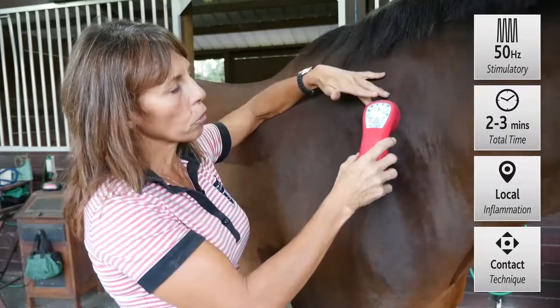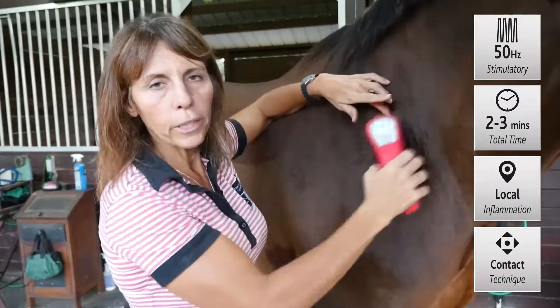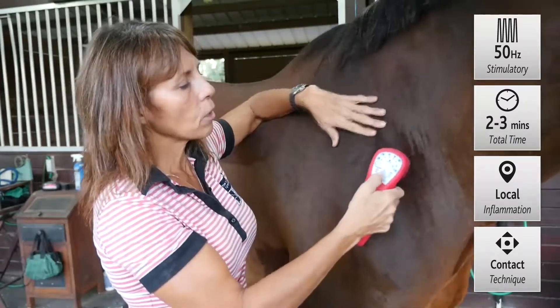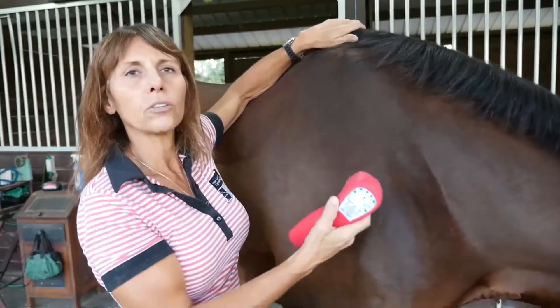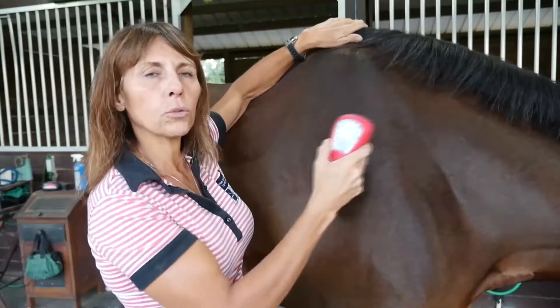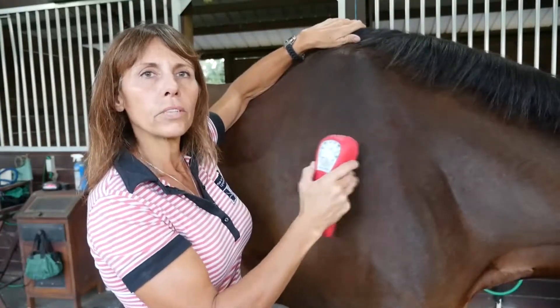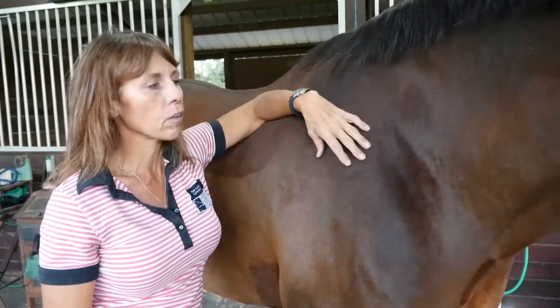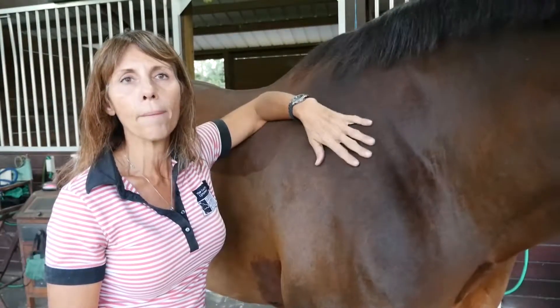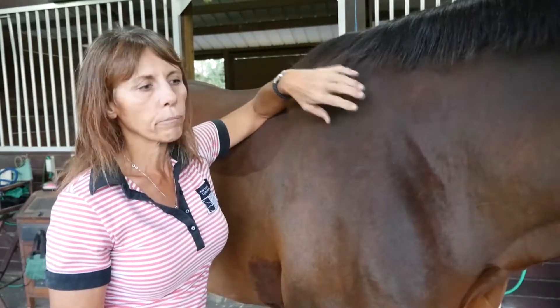We're talking about a peripheral nerve treatment here, and then you may change your settings for more of a musculoskeletal effect for the actual muscles that are affected. This is a chronic condition — it takes a long time to heal. Sometimes it's nine months of rehab with stall rest for these horses, and it's a real challenge.